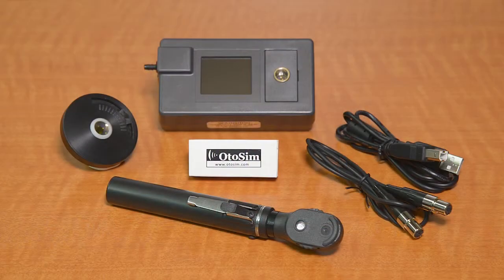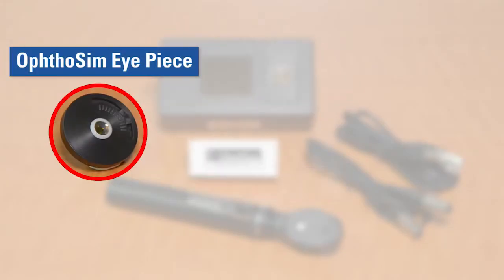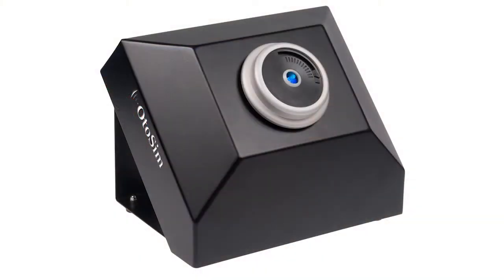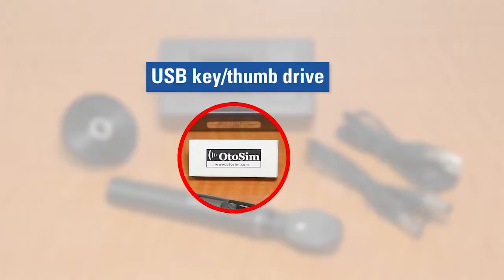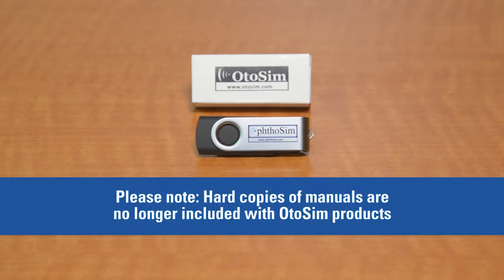Your OphtoSim upgrade kit consists of the following components: 1. OphtoSim sensor box. 2. OphtoSim eyepiece — this is the lens that is placed on top of the OphtoSim display unit. 3. USB key or thumb drive — this contains the software installation package for a PC or a Mac computer, as well as an electronic copy of the installation manual. Please note that we no longer provide hard copies of product manuals.